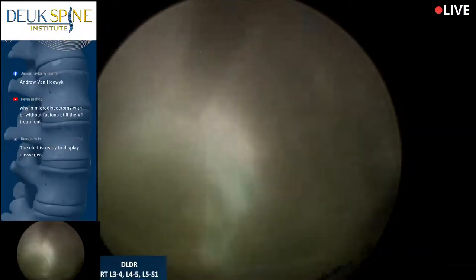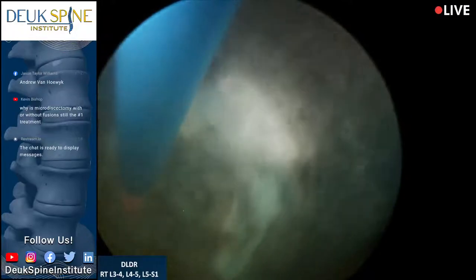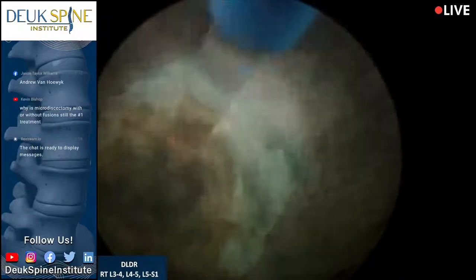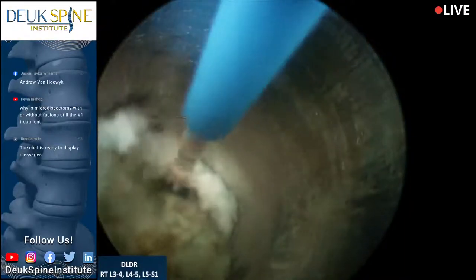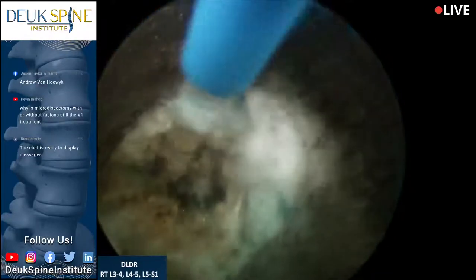All right, welcome back. Hope you enjoyed the video again, showing how the laser cleans out the tear, gets rid of the herniation that is stuck inside the tear, causing all the pain. And that's what we're doing. What you're seeing here is the tear. And I'm cleaning out the jelly stuck inside the tear.